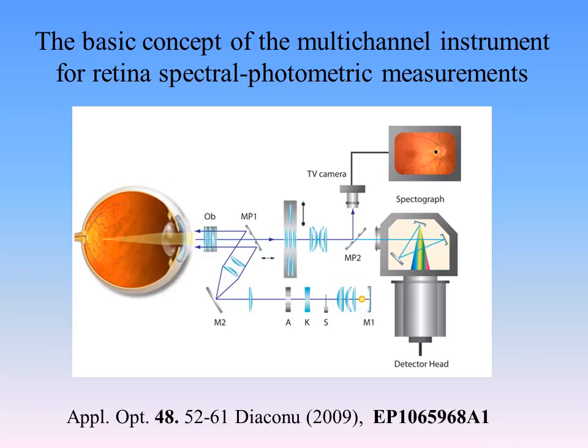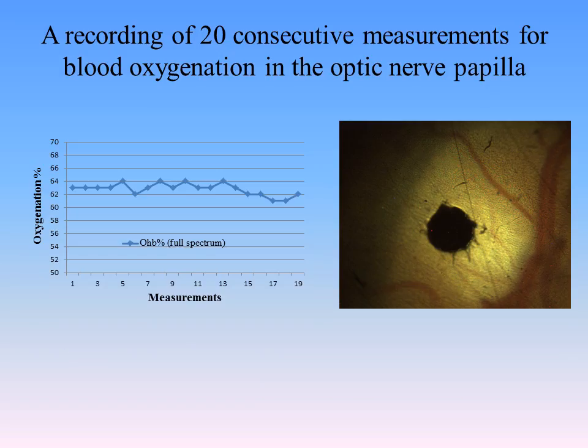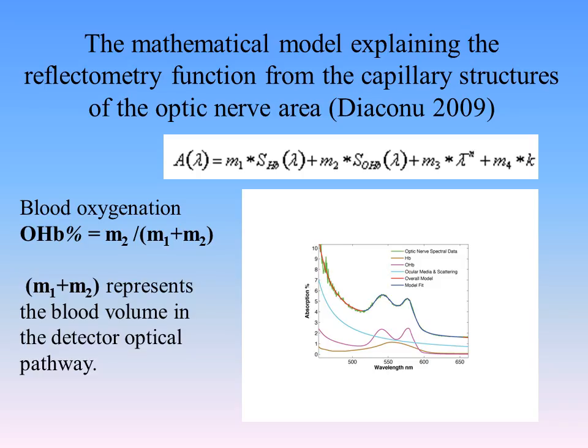That is the experimental setup. We change the parameters to fit. After the computation of 4 parameters here, we check if the data here fit too. We make two different computations. It's not only one, because if you make only one, you can obtain a fit with some differences here that can have error in the blood oxygenation.